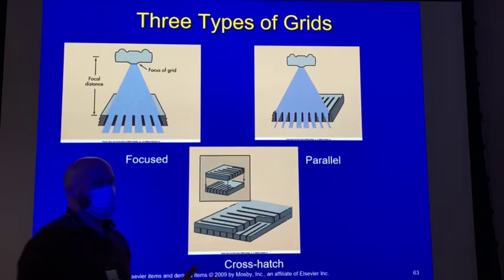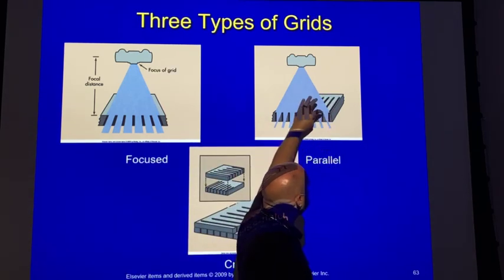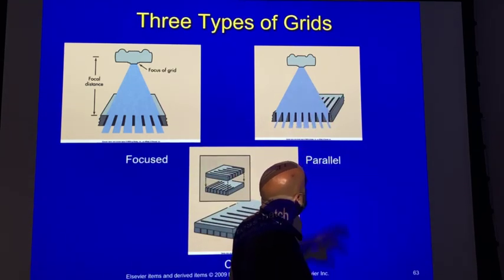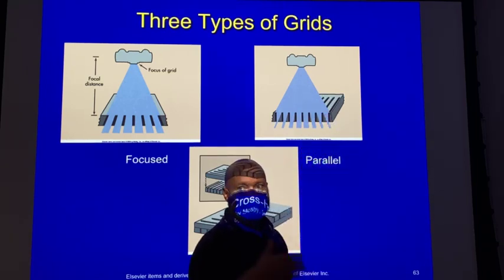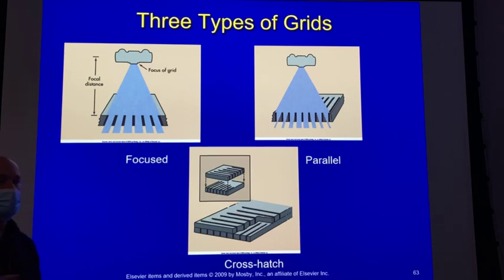Now when we see those grid strips, especially when we've got a broad swath of our remnant beam cut off, we call that grid cutoff, okay? There are a lot of different reasons for grid cutoff that we'll look at here in a bit.